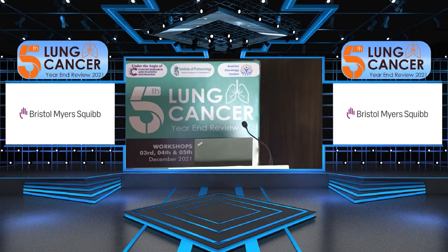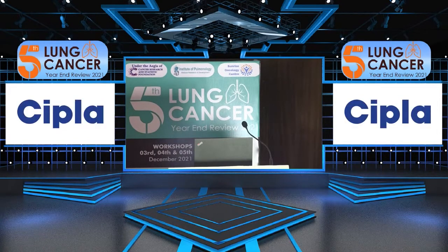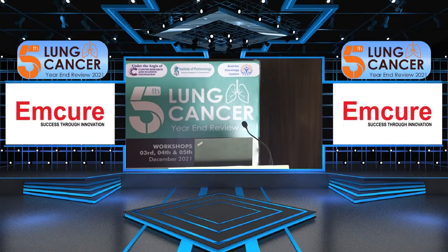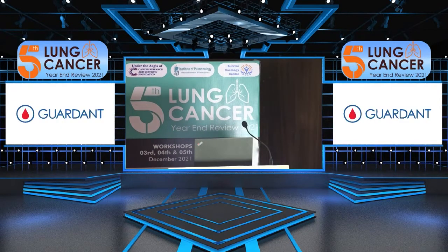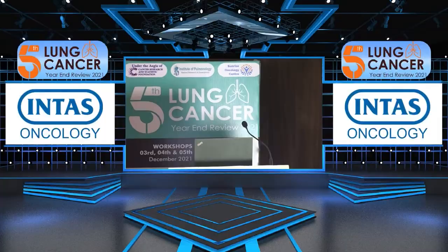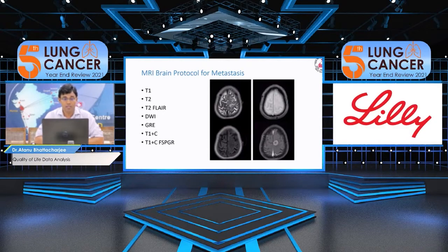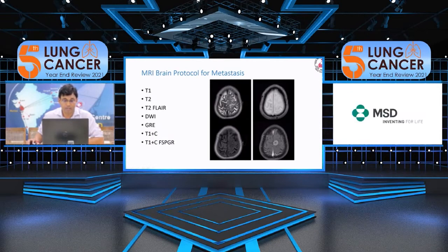So basically, when we are talking about staging, brain metastasis plays a significant role because it will upstage the disease significantly. The incidence of brain metastasis in patients with lung cancer is around 20%, and it is part of the guidelines while deciding whether you want to do SRT or WBRT. There is a specific protocol to be followed when we stage the brain, with some specific sequences like T1, T2, FLAIR, diffusion, GRE, and the post-contrast sequences, which have their own significance.